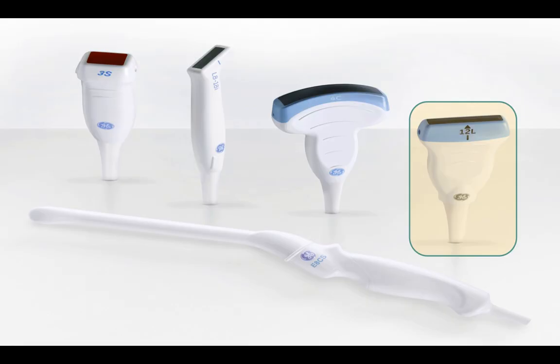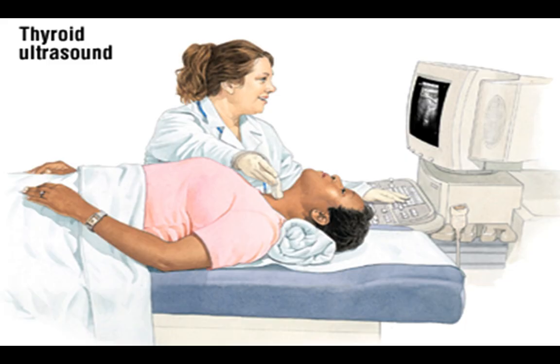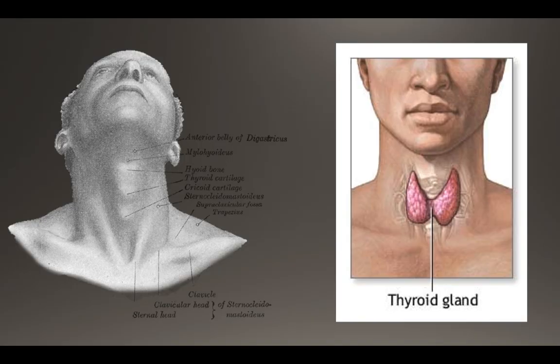When you scan the thyroid you want to use a linear probe. The thyroid is a superficial structure and the high frequency of this probe will get you good image resolution. The patient should be in a supine position with their neck extended, and it may help to place a pillow under the patient's shoulder blades to enhance neck extension and positioning — this can be really useful in patients with a shorter neck. You start the scan with the probe right above the sternal notch. The probe indicator should be to the patient's right when in the transverse plane and towards the patient's head when in the longitudinal plane. To visualize the entire thyroid it will probably be necessary to slide the probe laterally and fan cranially and caudally.